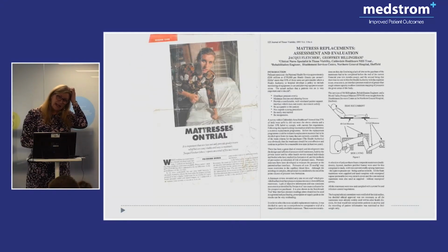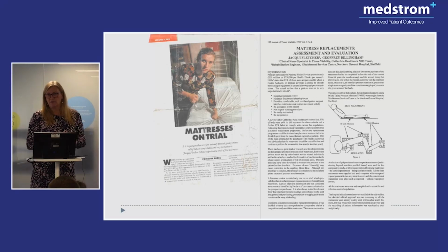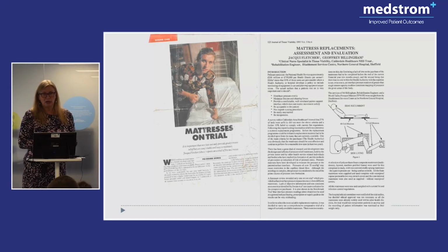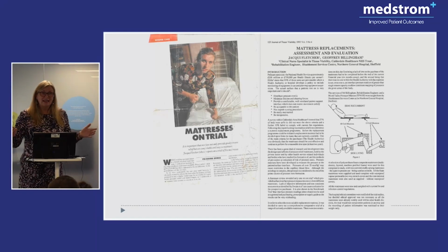So this is slightly embarrassing. These were my first forays into interface pressure measurement, when I worked originally in my first tissue viability post, that says 1993 at the bottom. It's one of the things we did. It was all we had. So when I did my first mattress audit, I was pulling out horsehair mattresses and the old, crinkly staff check mattress covers and things, and we needed something better.